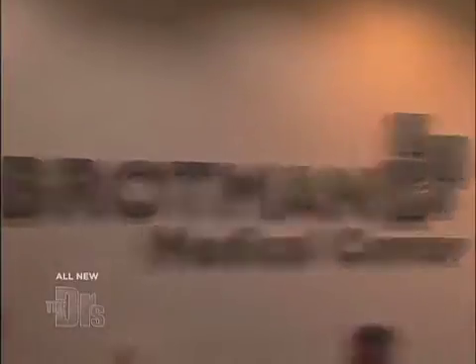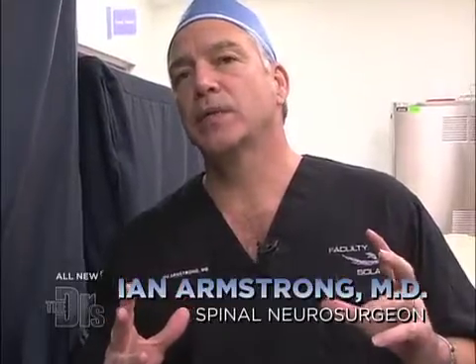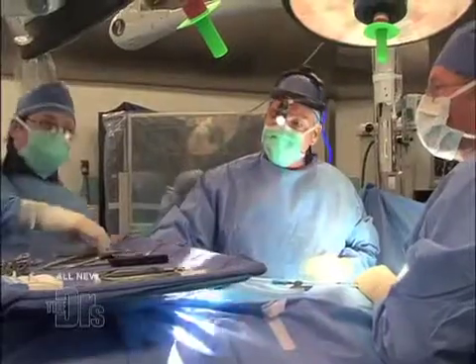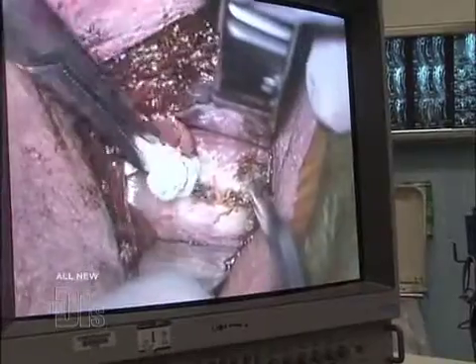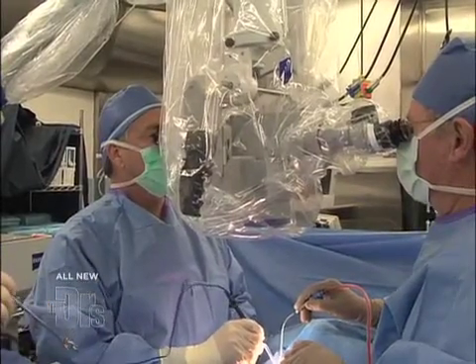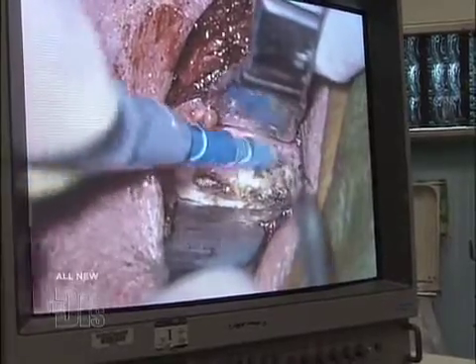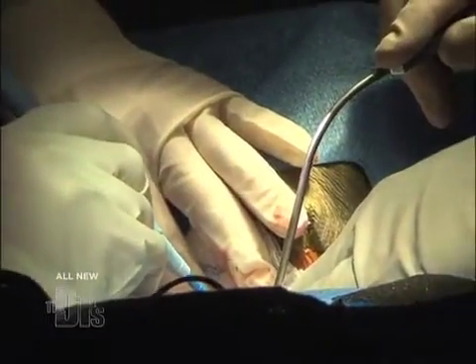Today's surgery is going to be an anterior cervical discectomy in what I call a physiological stabilization or a fusion. This is the initial incision. The anatomy here is just so intricate, so delicate. We move past the esophagus, the swallowing tube, the trachea, the carotid, and move them out of the way to get right down to the spine.